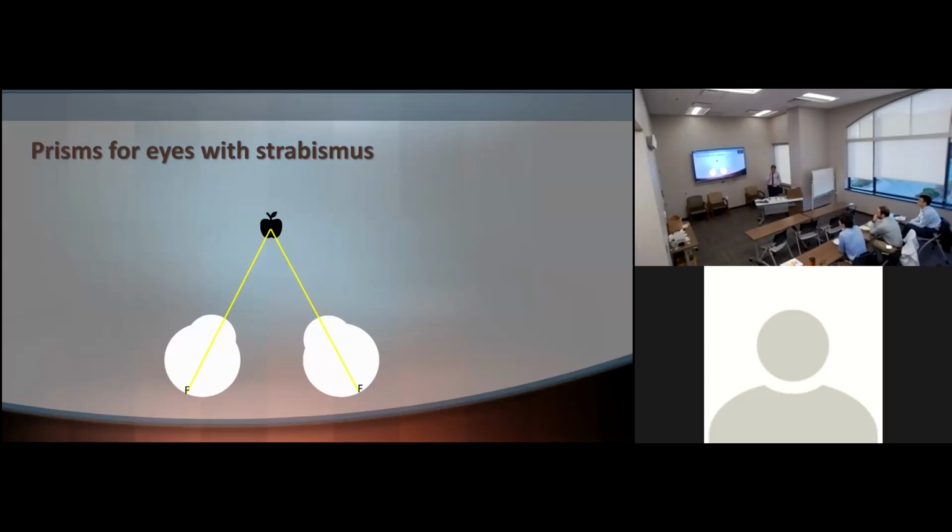Same concept with the 4 prism diopter test. We hold the 4 prism base out at this point to see if the small suppression scotoma persists. That will help do so. Now we get the concept of holding prisms in front of the normal eyes and how we can measure the divergence amplitude, whether it is convergence, divergence, vertical divergence as well.